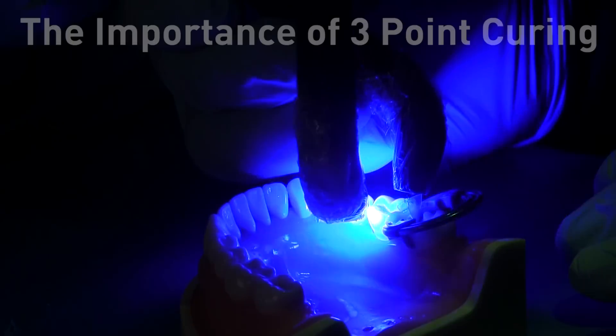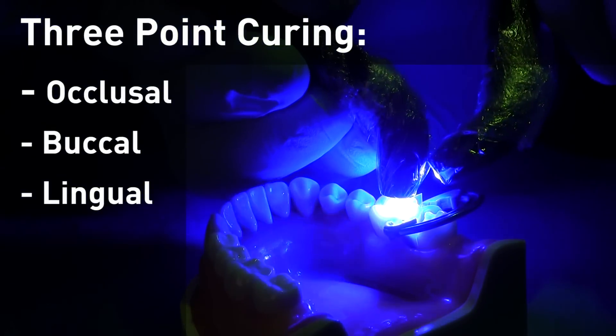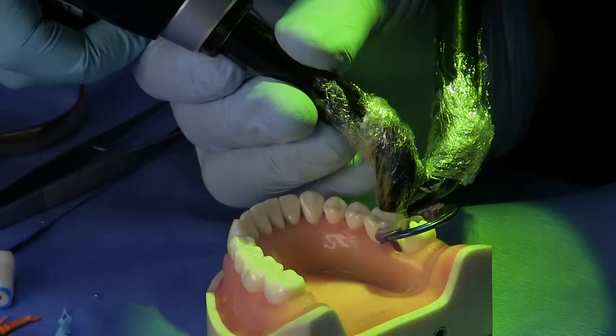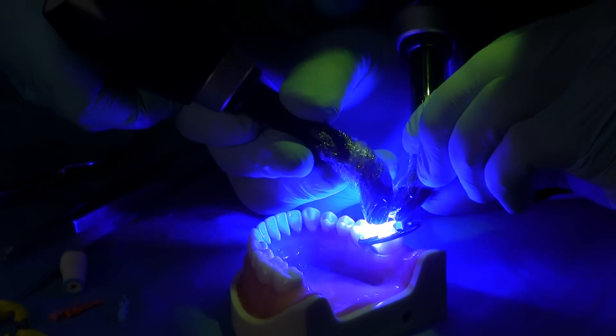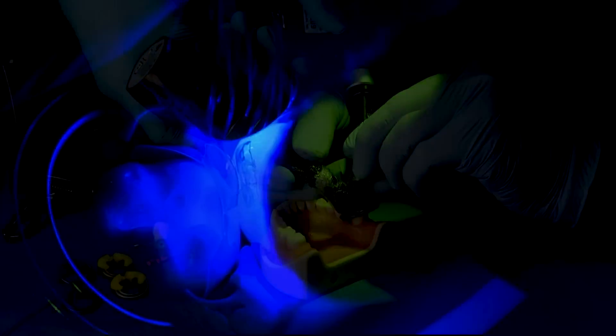True bulk filling requires three-point curing. Three-point curing is curing from the occlusal, the buccal, and the lingual. A clear matrix is a distinct advantage — it allows more confidence that we have a full cure and fewer layers are required.